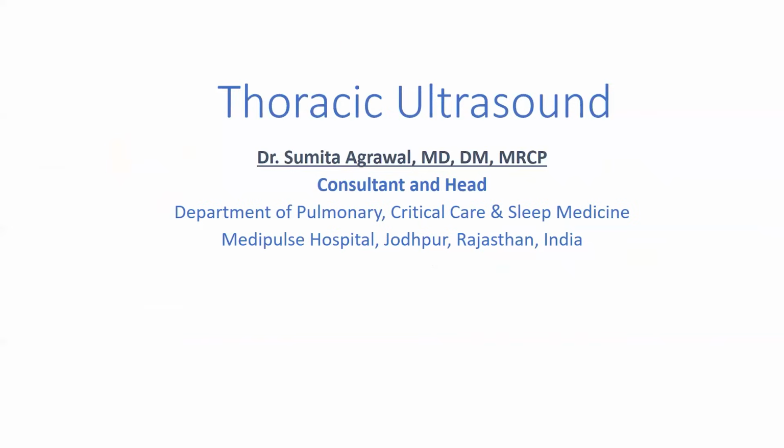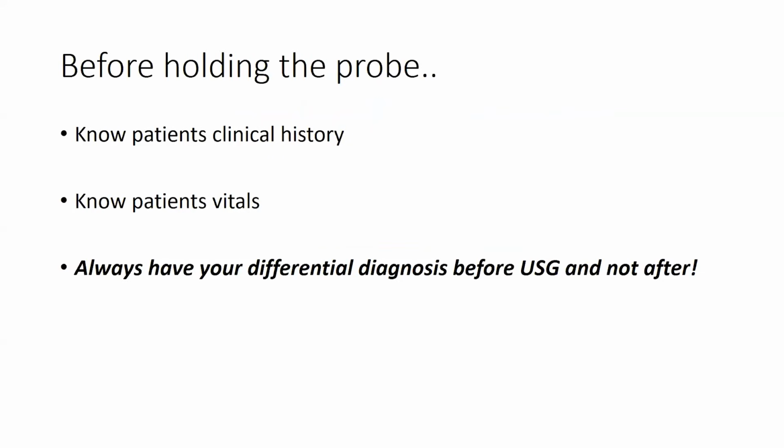Hi. Good evening, everyone. Today, I'll be discussing thoracic ultrasound and its implication on a case-by-case basis. First and foremost, before moving to the case, it's important to know your patient's clinical history and vitals, so that you have a differential diagnosis before your ultrasound, not after.